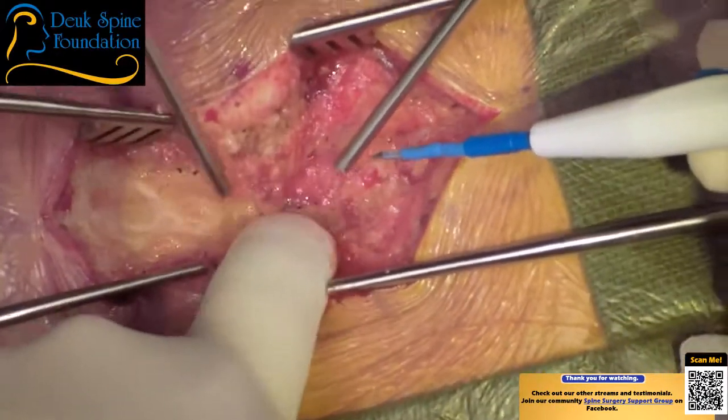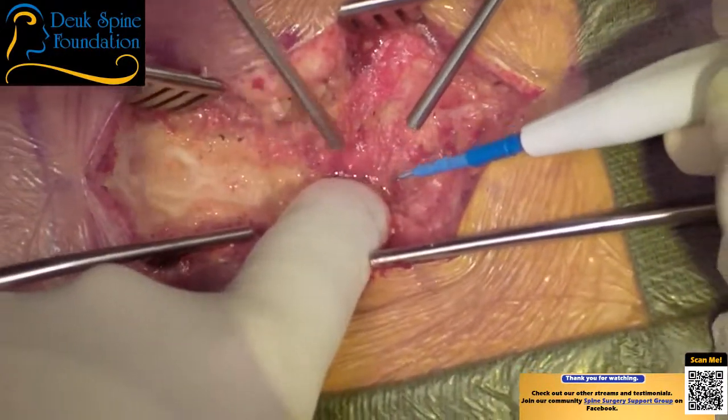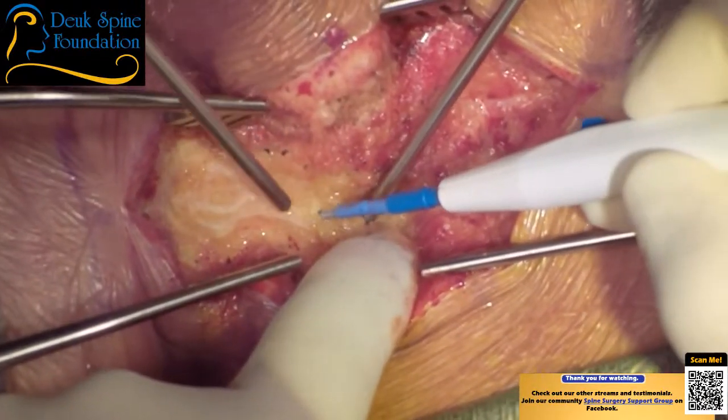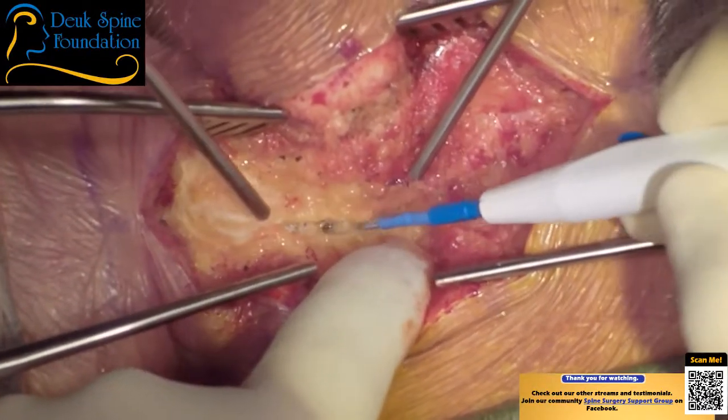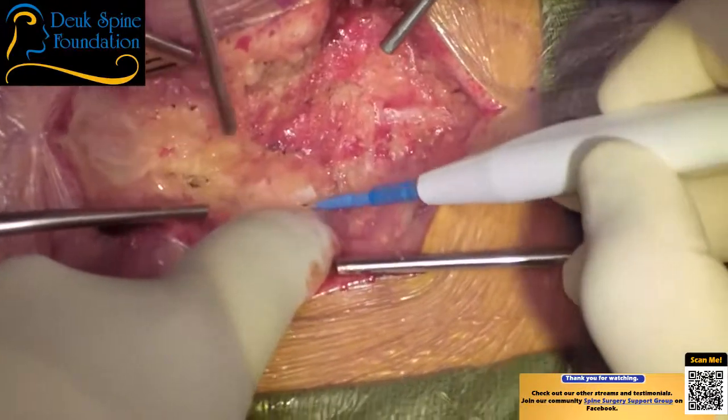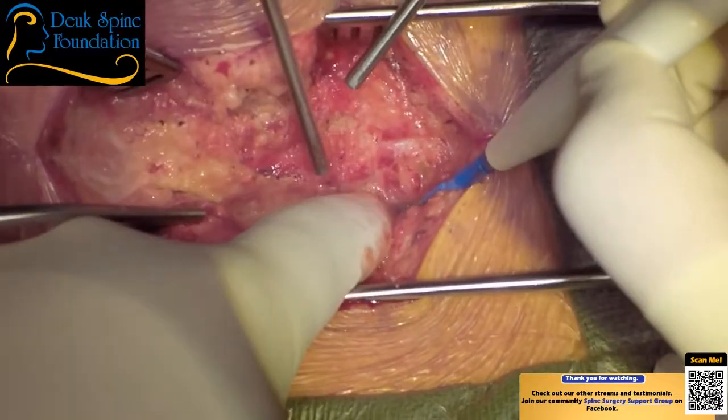So here, there's something bony right there. And I feel the spine there. The spinous process is pretty deep. And there's the fascia. There's the spinous processes. I'm going to get a bigger retractor in a minute.